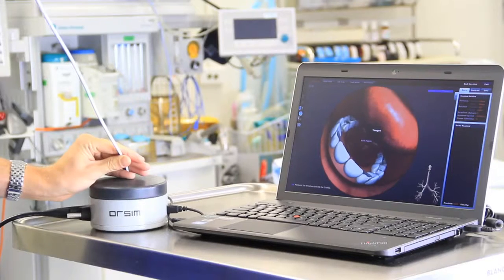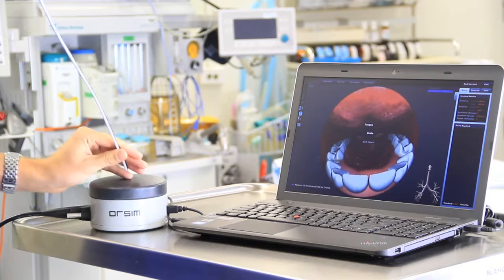If you want to be an expert at managing difficult airways, you need to practice on difficult airways. I'm Paul Baker, I'm an anesthesiologist, and I've devised an instrument that will allow you to do that: the ORSIM bronchoscopy simulator.